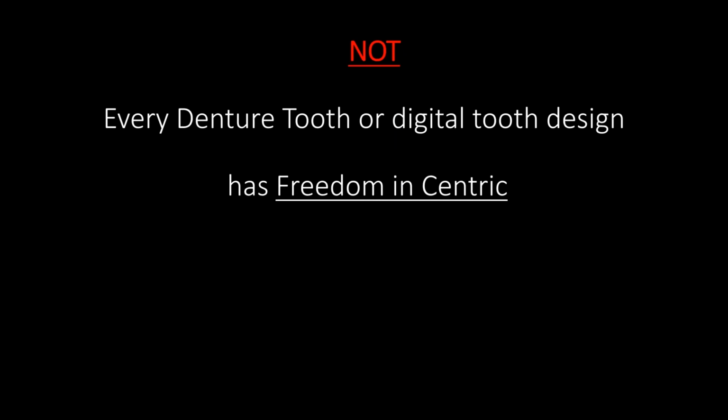It goes right into working and balancing. Then Ivoclar Veneris 2, and Merz Dental Artiface posterior teeth. Those are the only ones that I know of. One would argue Candulor, from the lingual occlusion point of view. That's it. It's a very small base of denture teeth and posterior teeth that have that.